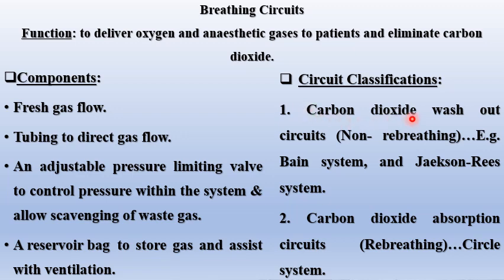Maybe carbon dioxide is eliminated by washout from the circuit. So I will depend on gas flow to push carbon dioxide out of the circuit, so the patient will not rebreathe his expired gas. So it is non-rebreathing circuits like Bain system and Jackson-Rees system, and we will see.